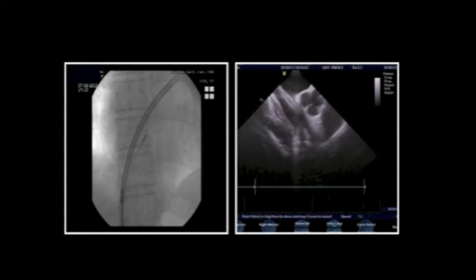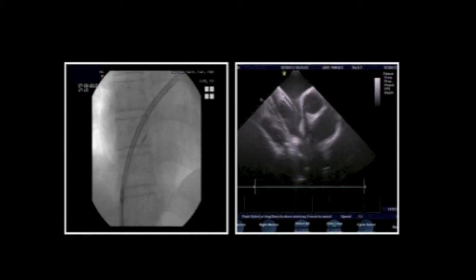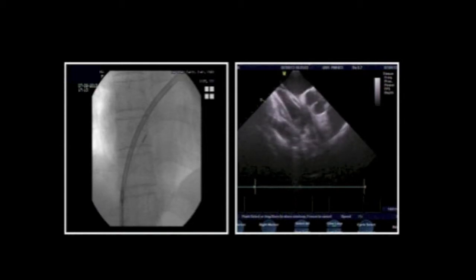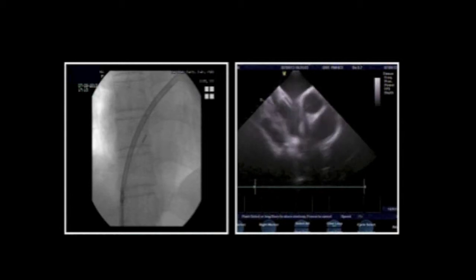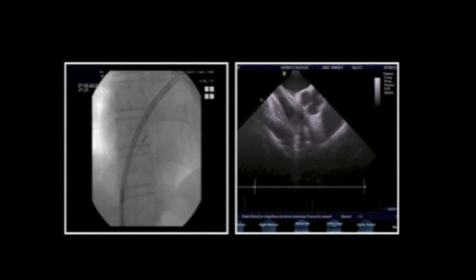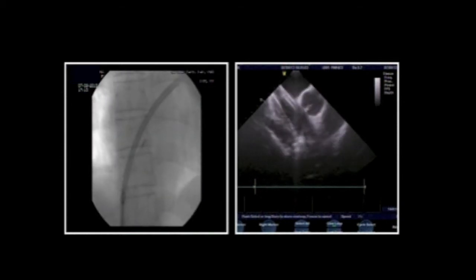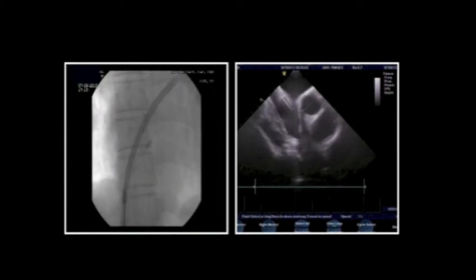That's my advice. But I've seen this several times, and often it's provoked by the instrumentation, and sometimes it just disappears when you take the sheath out or you give one dose of amiodarone, and I often just wait 24 hours to see what happens. But it's a very good point. What do you think, Anna? Should we proceed here? Yeah. Because apparently it's in and out. Sometimes it's sinus, sometimes it's AFib. So Anna is saying it's also here in the cath lab, she's not in it all the time.